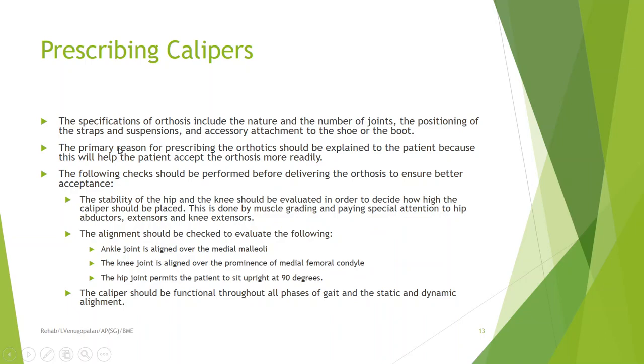Like you would want to know exactly what is the composition of each and every medicine, but at least you would want to know exactly what medicine is taken for which purpose, right? So similarly, if you explain to a patient, hey, if you wear this orthosis, it is going to aid you do such and such job better than what you are able to do now, then the patient would be more open to accept the orthosis, because already they are psychologically affected with their disability, and you do not want them to wear a device that is going to make them more self-conscious, right?